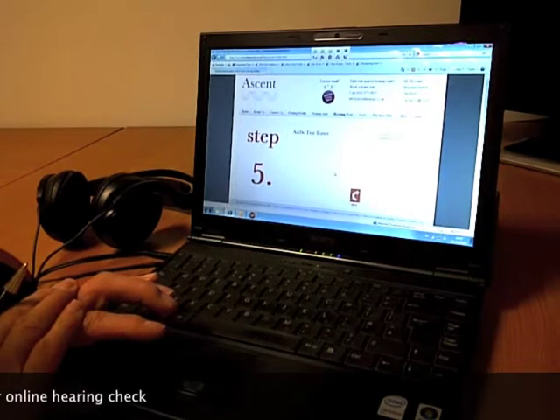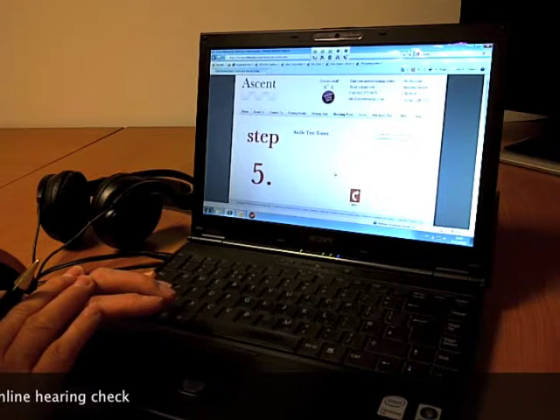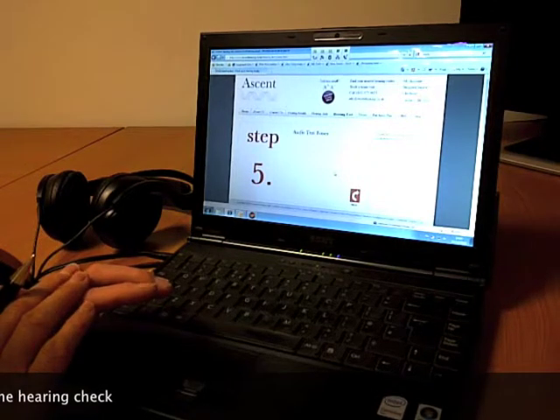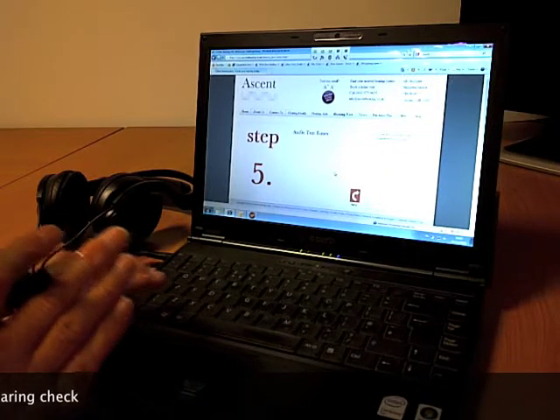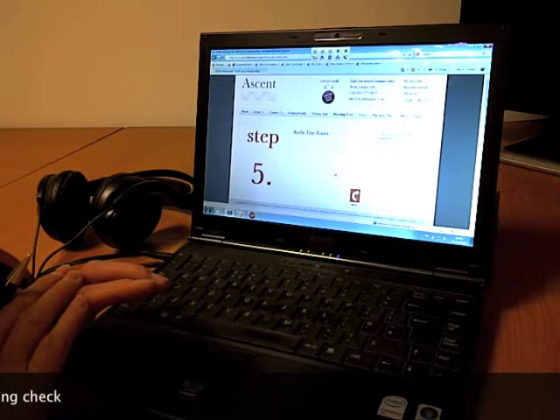And my strong advice is, if you do the screening test online, or a friend or loved one does the screening test online, and for any reason there is a little problem, please contact us. Have a free and without obligation hearing test in our centre, local to where you live, and let's check that everything's okay. It could be something as simple as earwax, and amazingly we offer an earwax management service through our network of registered hearing aid dispensers who are trained and approved and certified in what we call primary ear care.